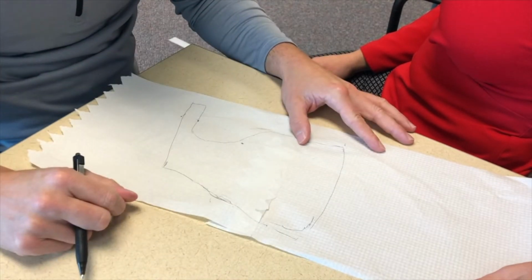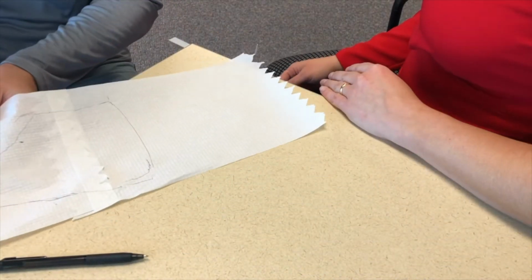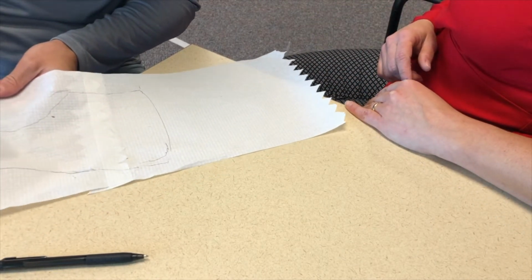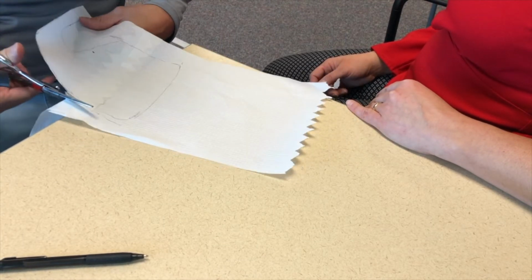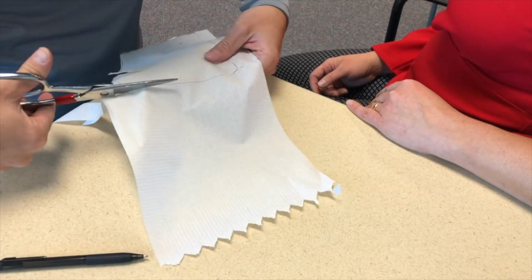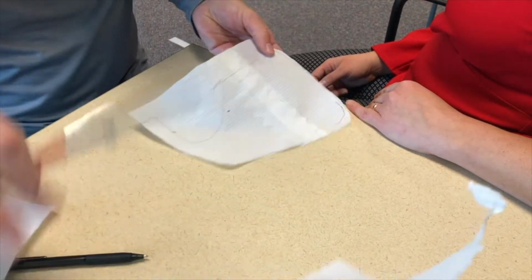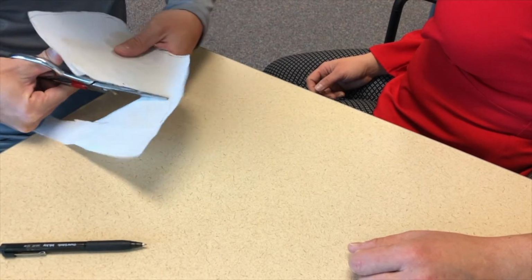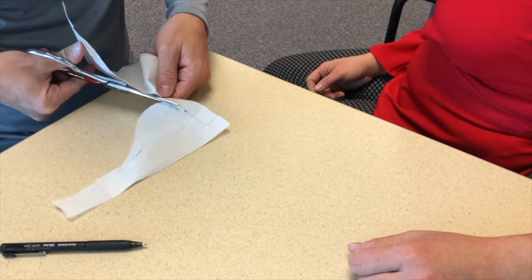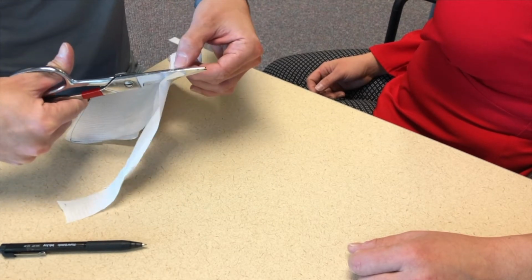Now we're going to cut the pattern and test it on the client. So we have the client aside. We'll take our scissors, and all we're going to do, it's like grade school, is cut our trace. As you can see, we added some tape because we took 2 pieces of paper towel; here at our health center, the paper towels can be a little short depending on the splint you're making. So we wanted an adequate piece, and we simply taped 2 pieces of paper towel together. Always remember to follow your pattern. Don't leave extra material.